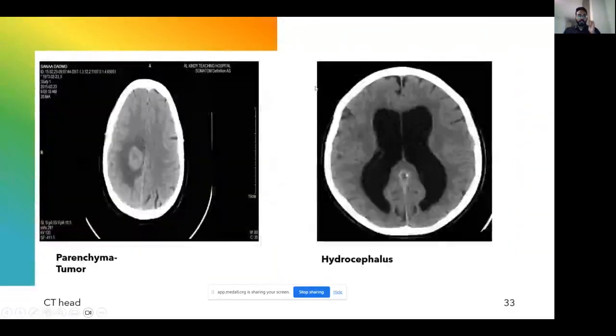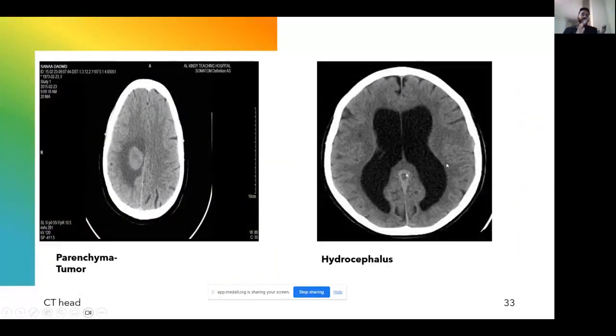Okay. Now, so we have finished blood. Next is V, for ventricle. Ventricle, you can see this ventricle obviously looks very much distended because of the CSF fluid that is stuck there. This is a case of hydrocephalus, will require shunting. So that you have picked up.